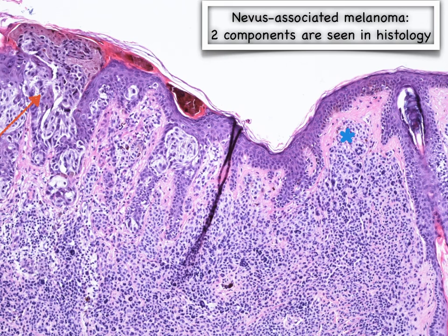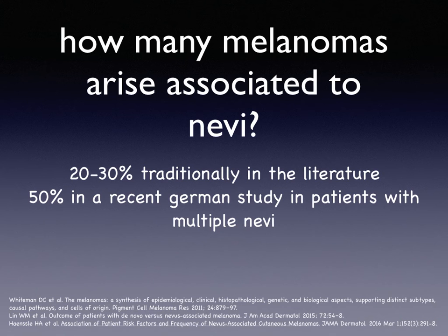Like in this case, where the blue asterisks indicate the benign nevus component, while the red arrows are pointing to the pagetoid spread of atypical melanocytes in the melanoma component in this nevus-associated melanoma.